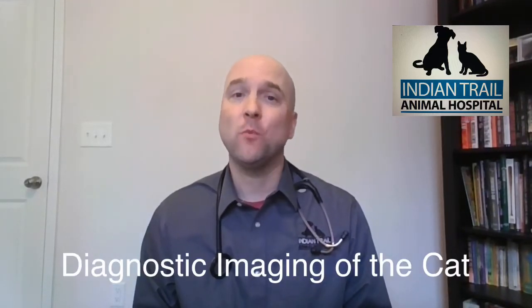I'm going to talk to you a little bit more about cat diagnostic imaging today. So diagnostic imaging is using specific tools to look at and view areas of the body that we may not be able to see or feel with our physical examination alone.